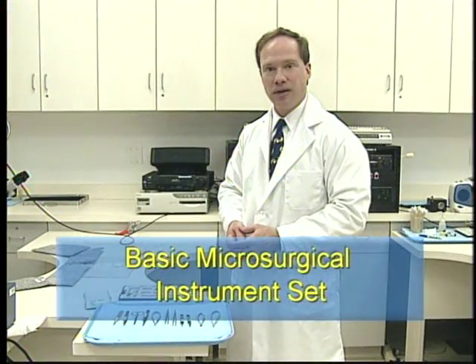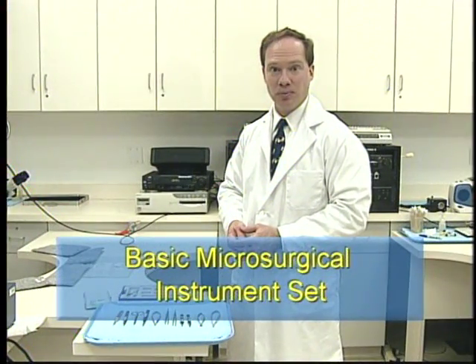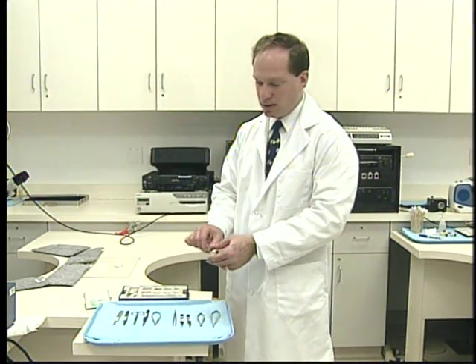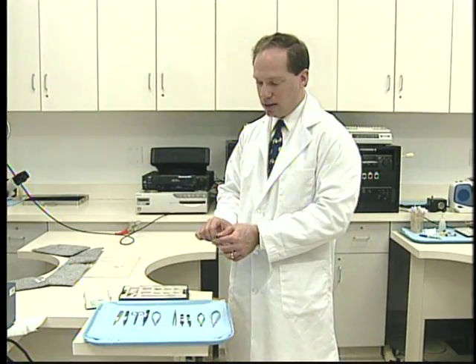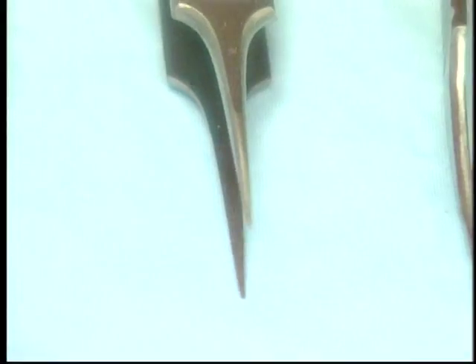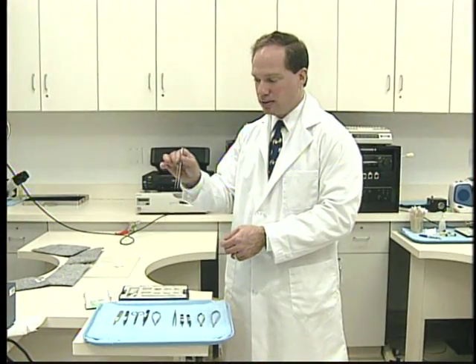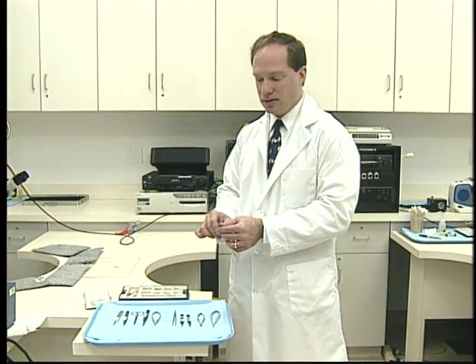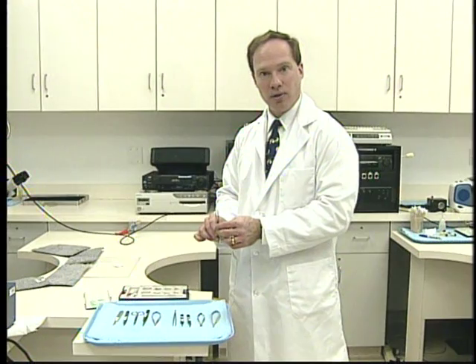These are the finely crafted instruments that make all this work possible, in addition, of course, to a trained microsurgical professional. Now, you'll notice that these instruments are very small, much smaller than the usual instruments in the operating room. They're very fine. The tips of this jeweler's forceps you can hardly even probably see. You can imagine what would happen if you accidentally dropped these on the floor with the tips facing down. These would be irreparably damaged.